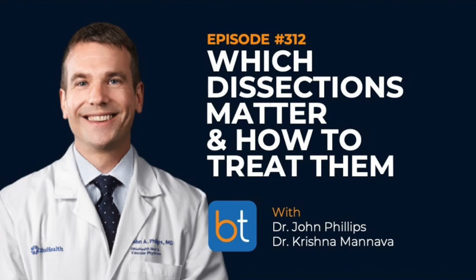I haven't gotten my hand slapped yet because it's recognized as a novel device. But in my opinion, you have to be smart where you think about putting it. Because if you talk to Phillips, they'll tell you, you've got to treat every dissection. Every dissection is flow limiting. But they're not. And you don't need to treat every one. But you need to think about them. Because I kept hearing over and over, well, our docs just leave it and they'll reassess it later. And in my mind, I'm like, I don't know, when's later, right? You either get it done now or don't do it, frankly.